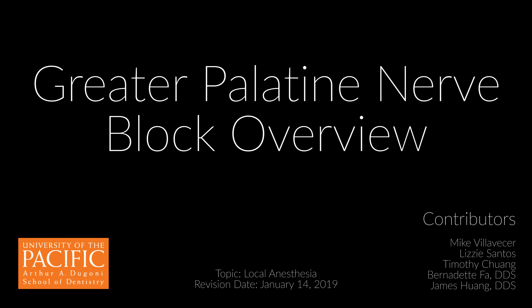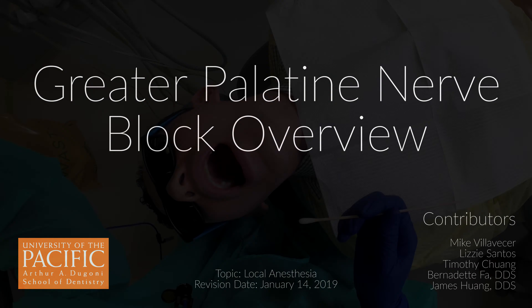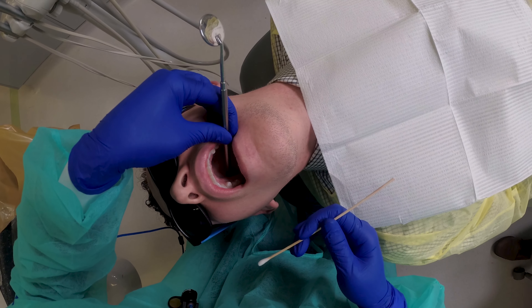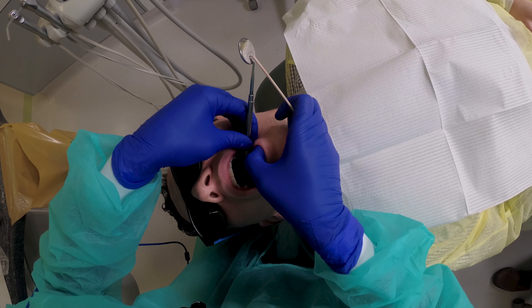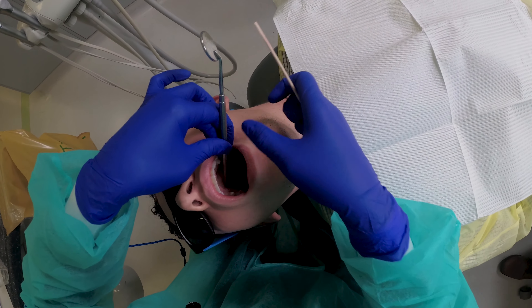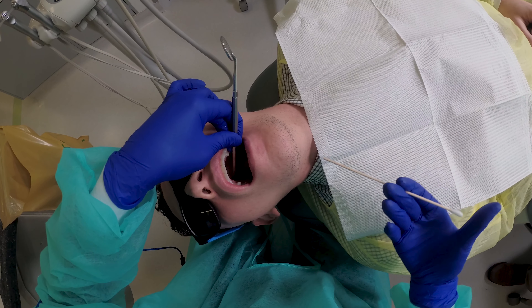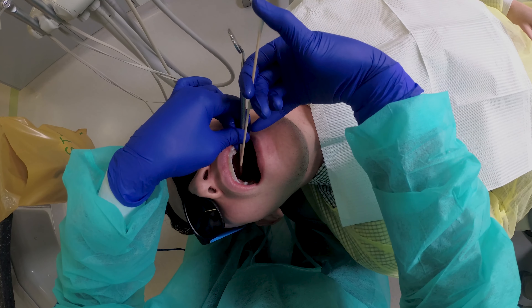Greater Palatine Overview. This is a visual walkthrough of the Greater Palatine Block Injection, which is used to anesthetize the palatal gingiva of the maxillary premolars and molars. This injection can be useful for maxillary posterior teeth for procedures such as crowns, fillings, extractions, or scaling and root planing.